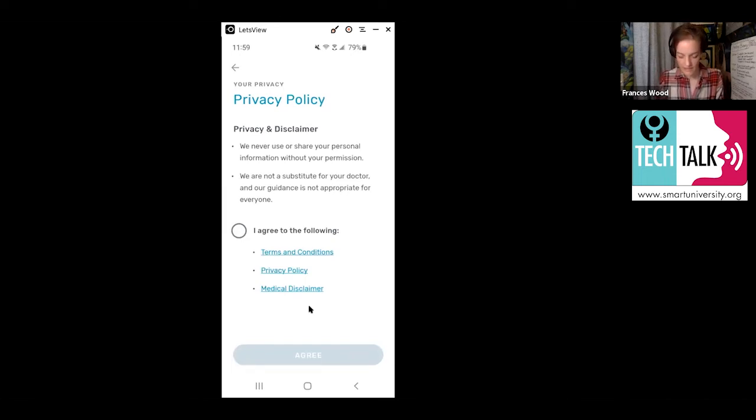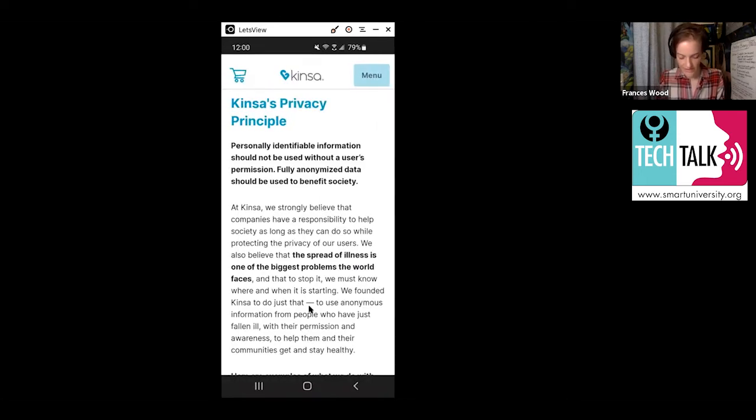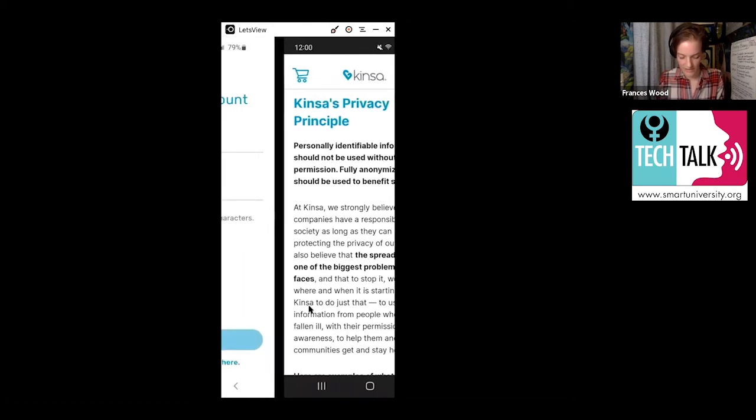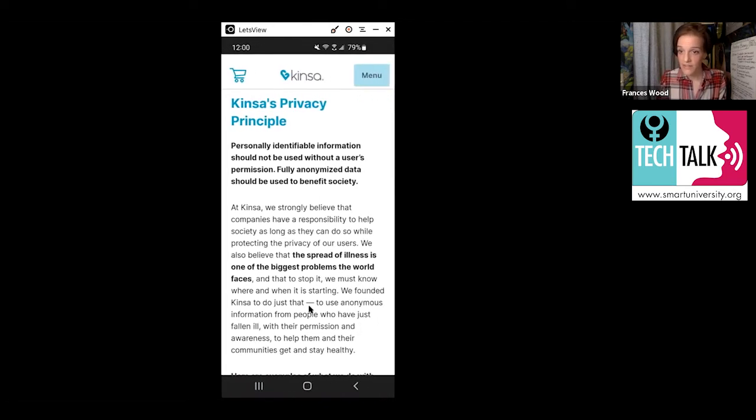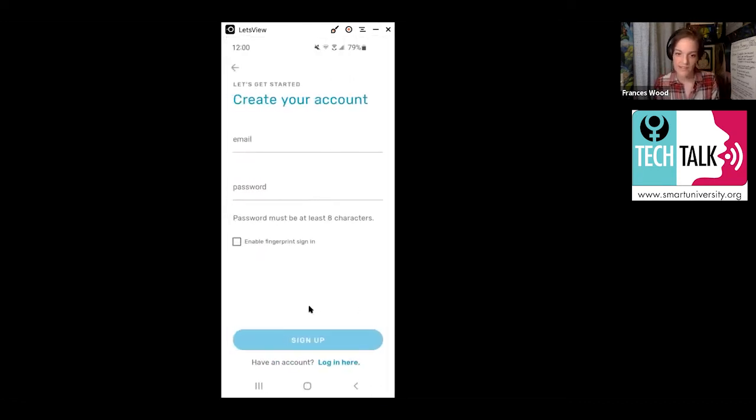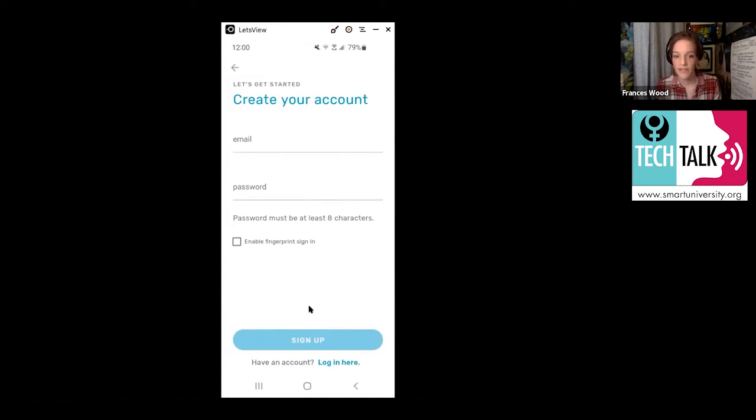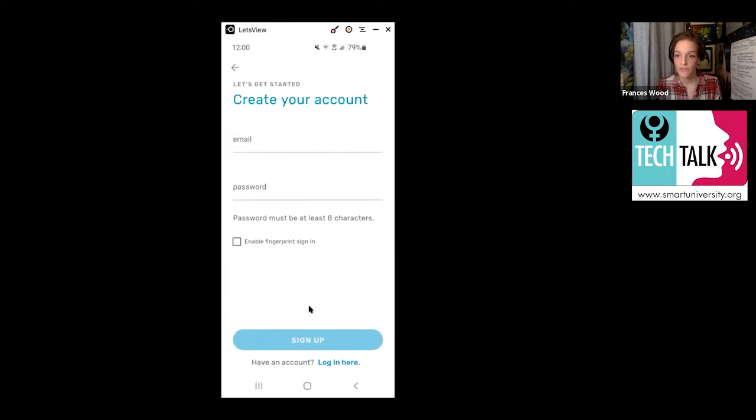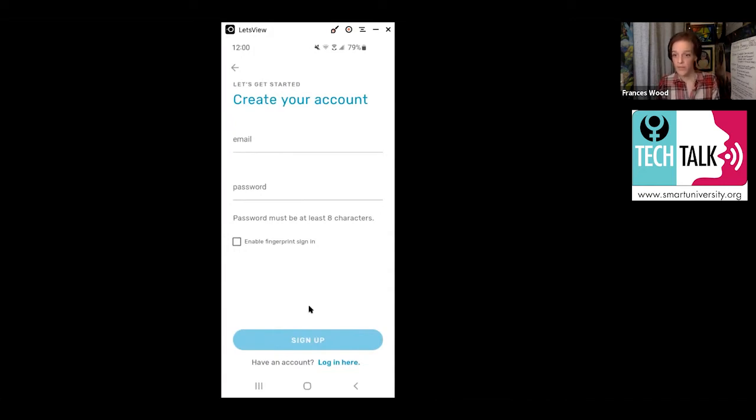This is the big part. It's going to say create your account. What you want to do is put in your email address, the email address that you use most often that you check. Then you're going to make a password of at least eight characters, and write that password down somewhere. Make sure you remember that password.